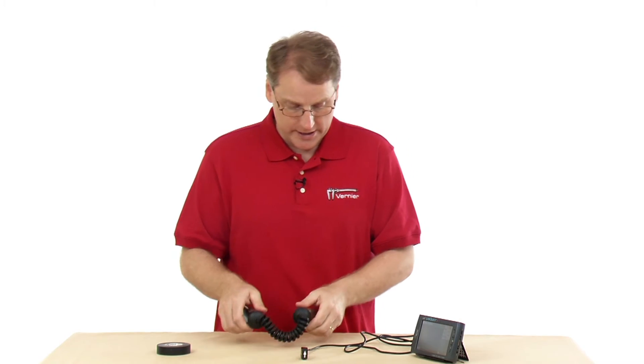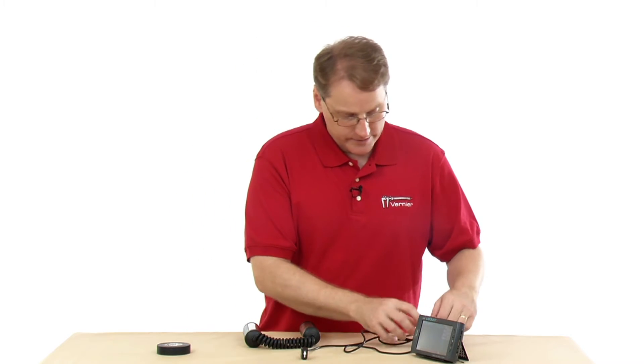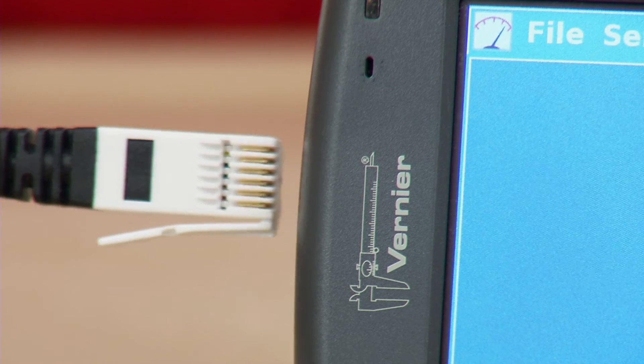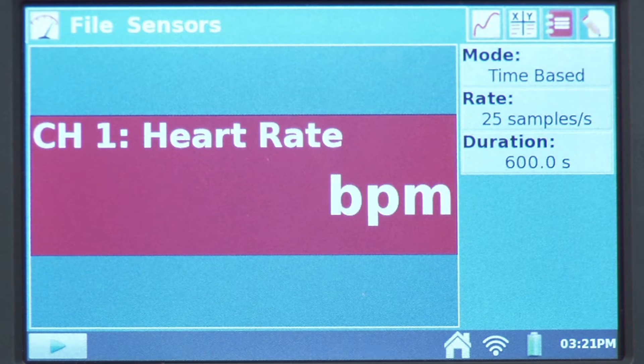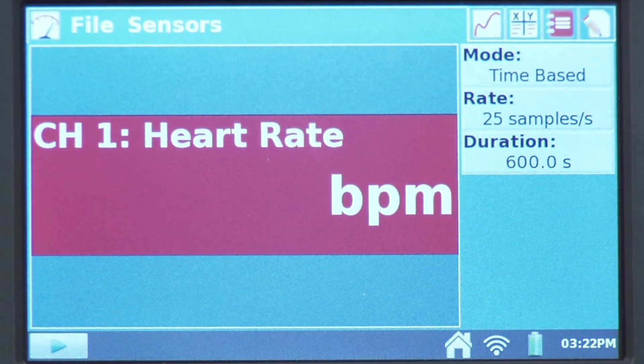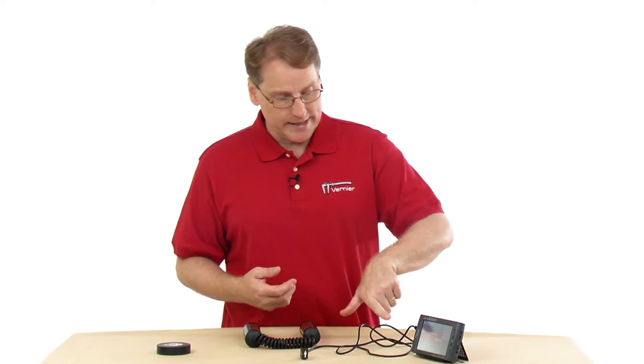Let's collect some data. I need to plug in my sensor, so I'll plug it into channel one. We see the device come up — the meter shows 'heart rate' in beats per minute. A common thing that happens is that someone has already been using a temperature sensor or another sensor and is accustomed to seeing a number show up on the meter screen right away.